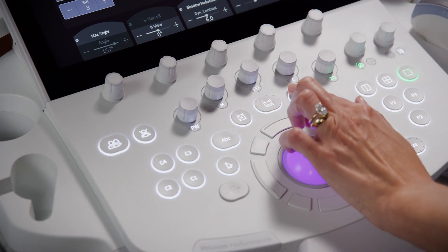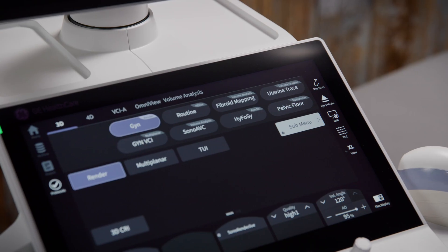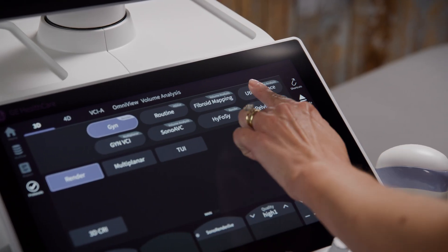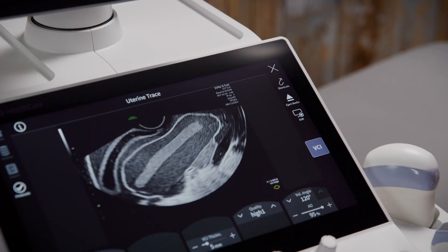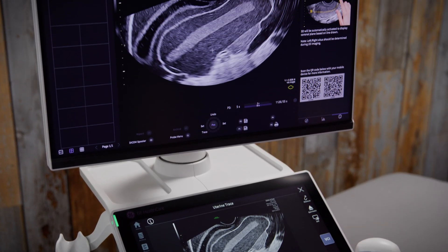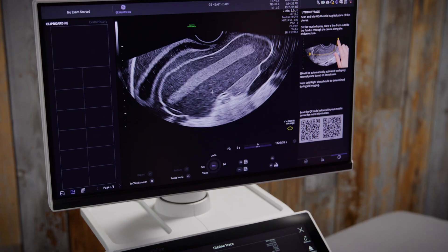Select the 3D button from your console and then select the uterine trace preset shown on the top of your touch screen. You will see the touch screen becomes an exact mirror of your monitor screen.